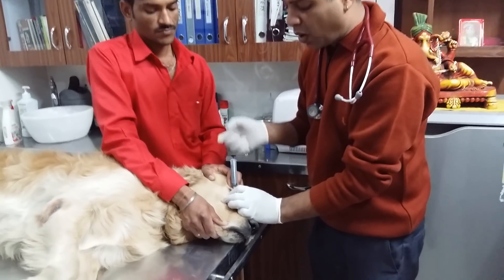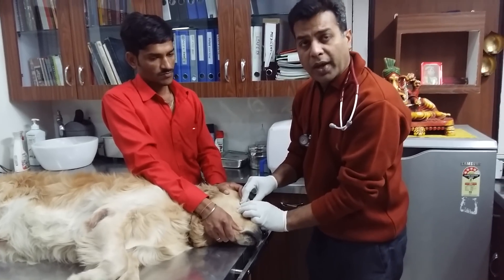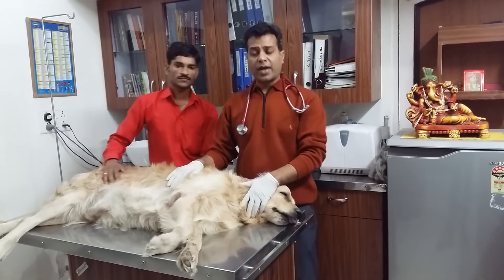If there is occlusion, we can use a small nylon wire which we can pass through this cannula to clear the occlusion. This is a small demonstration of how to pass this cannula to flush the nasolacrimal duct.